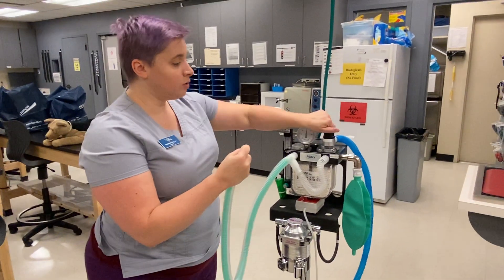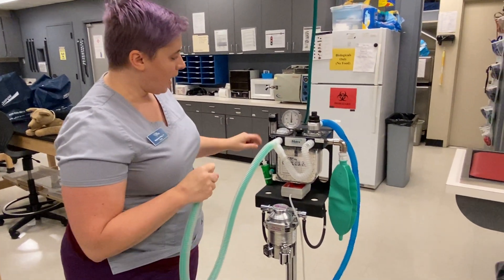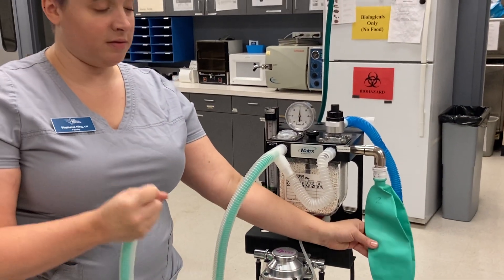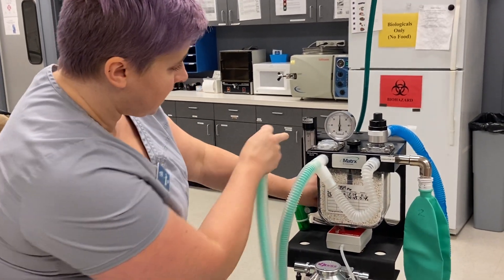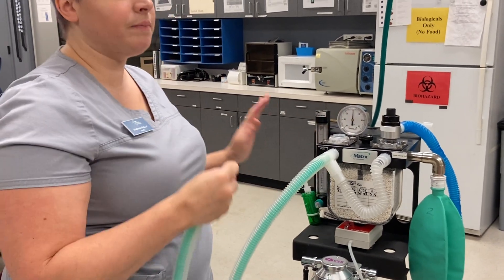I have closed my pop-off valve. I am closing the other end with my finger. I am now going to push on my flush valve and fill the circuit. Remember, the reservoir bag is where the animal breathes from. A lot of students push this and they don't see the manometer moving and they think something's wrong.